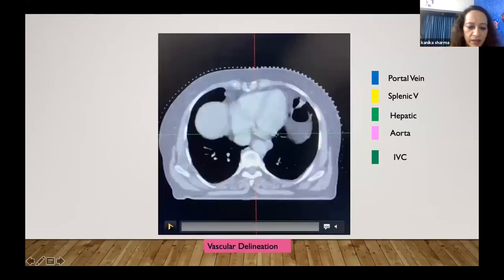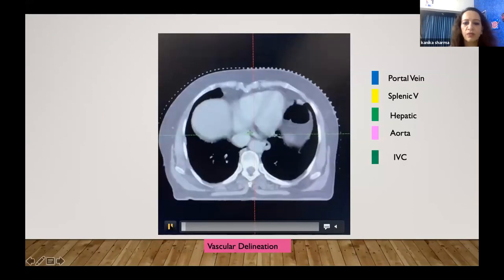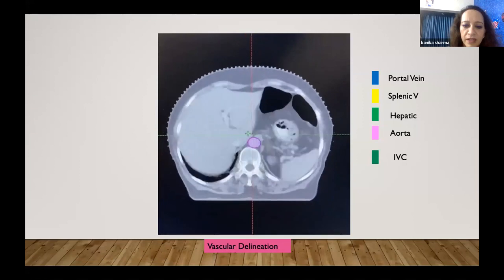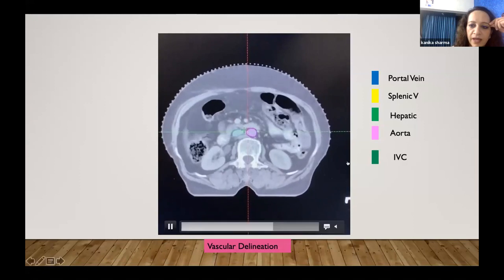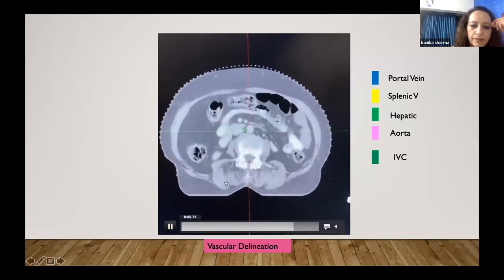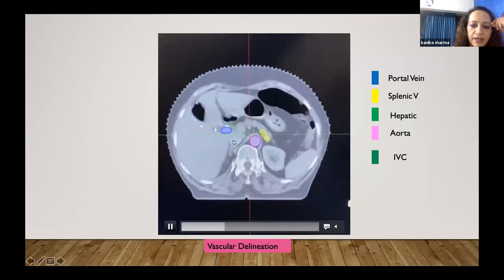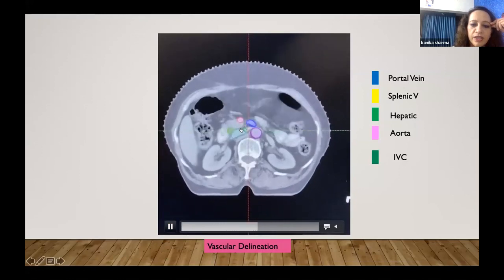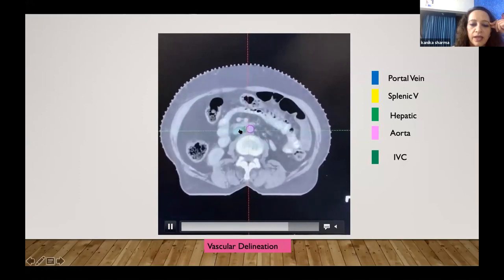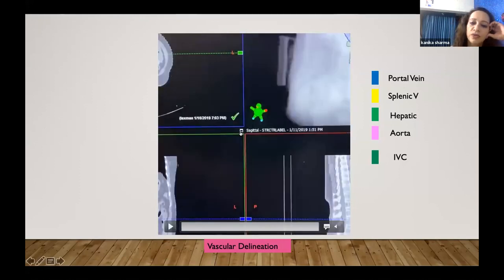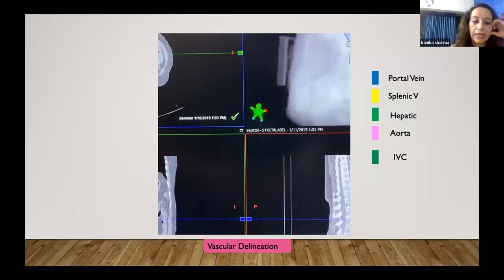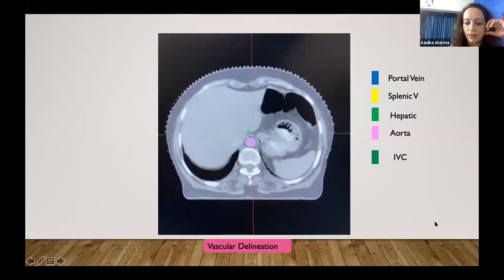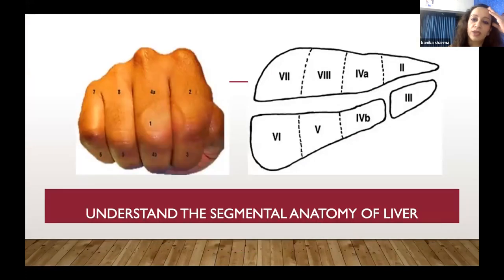To help identify vessels, we draw them in different colors. The aorta and IVC are drawn from where the liver exits. Ideally you draw vessels to at least the L2 level, which defines the lower caudal border of most portals for pancreas. Sometimes you need to draw much further down. The celiac vessel requires only the proximal 1 to 1.5 cm, and the SMA requires the proximal 2.5 to 3 cm to be drawn.